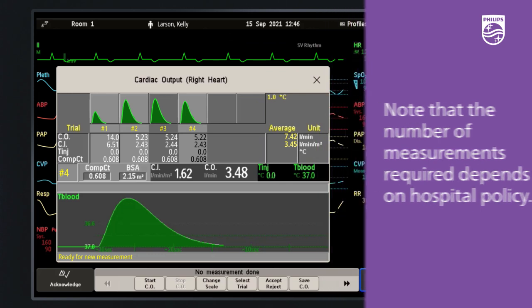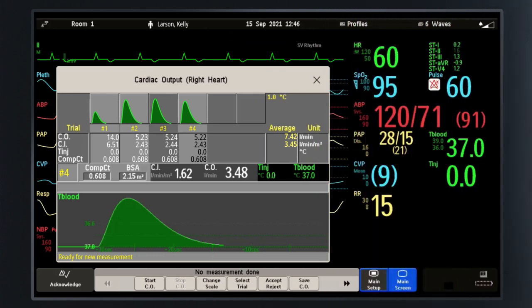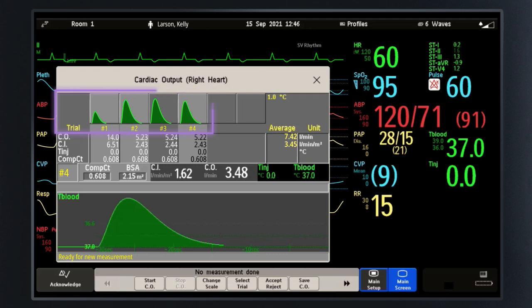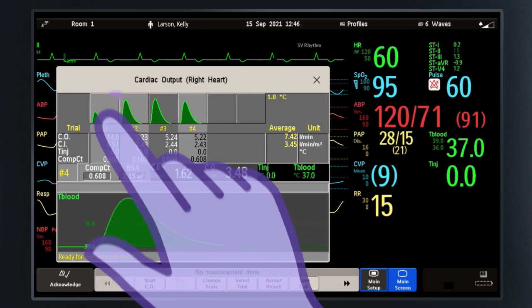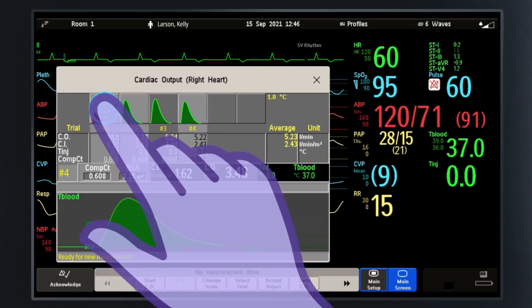Review the trials and reject any irregular trials or conspicuously different values by selecting the trial to turn the background red.